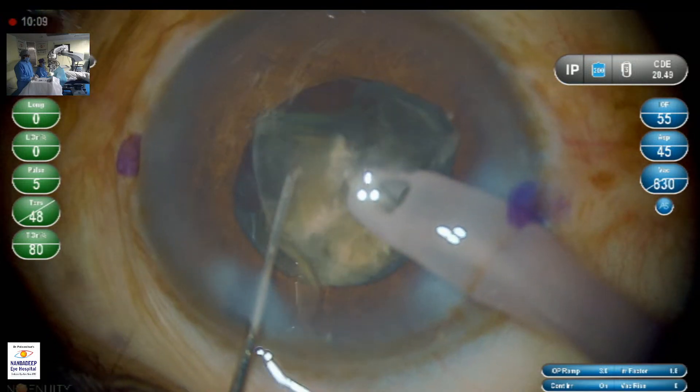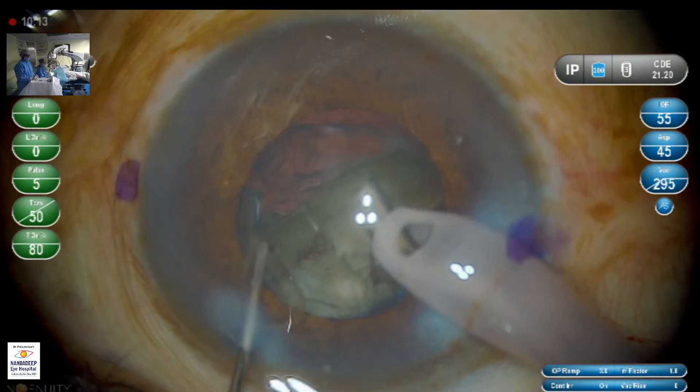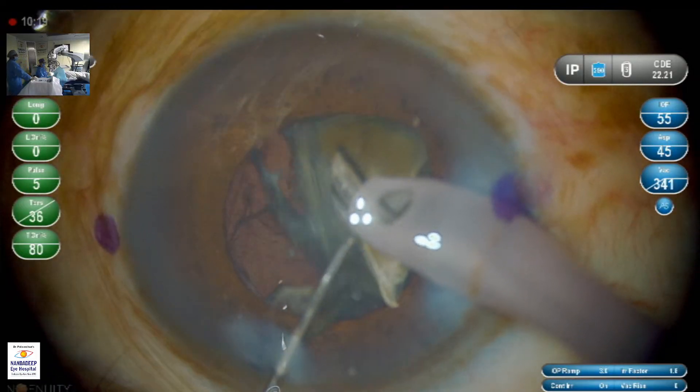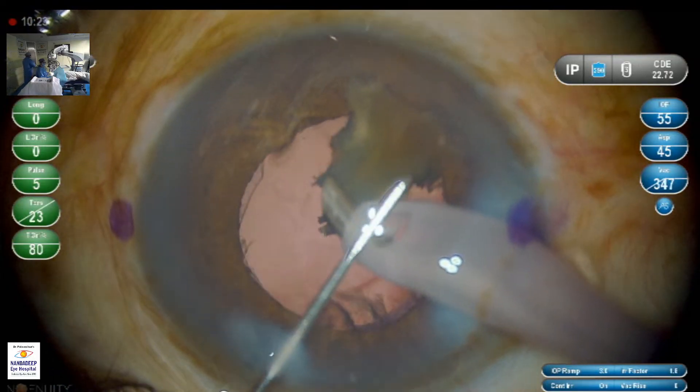You can see the dynamic movement of the phaco tip — the bevel is being taken downwards to grab a piece and then brought sideways, so that it is safer and there are no undue posterior capsule complications.